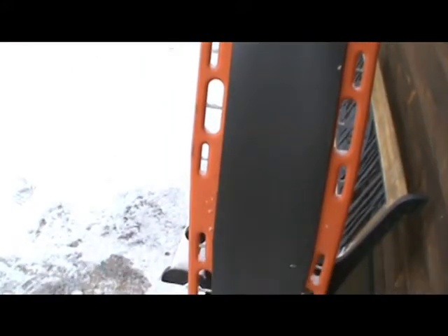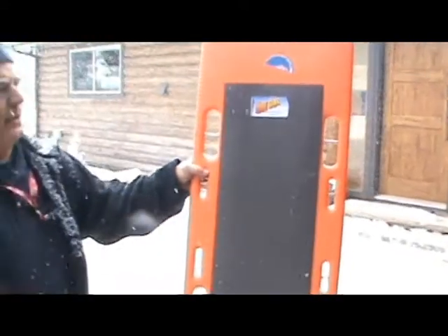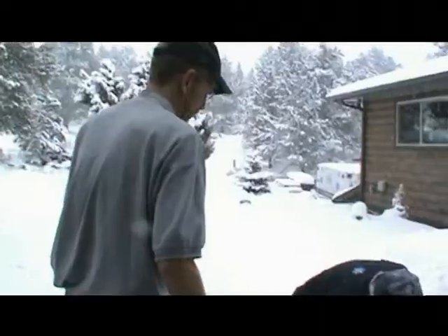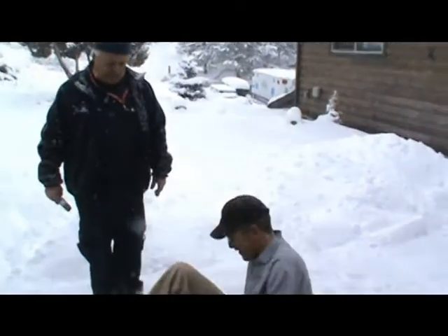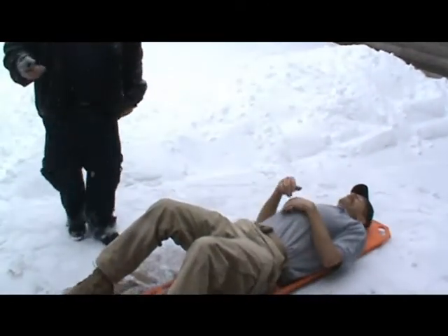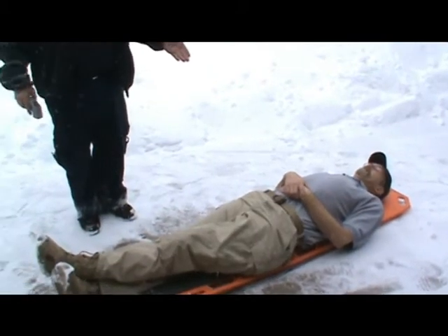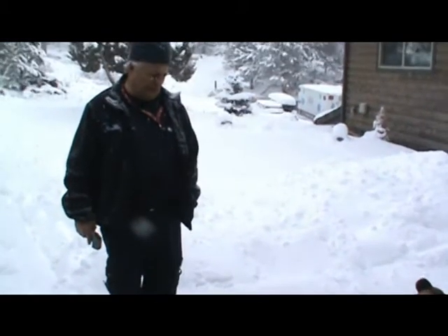So we're going to get our volunteer to step over here. You see the temperature of the plastic part of that board is 19 degrees. C-spine station, you all know how to do proper C-spine. Just for demo purposes of laying on this board, we've exposed our patient, and even in this weather, we're going to at least get their outer clothing off and lay them on that cold backboard, and I'm assuming they're going to feel much colder.